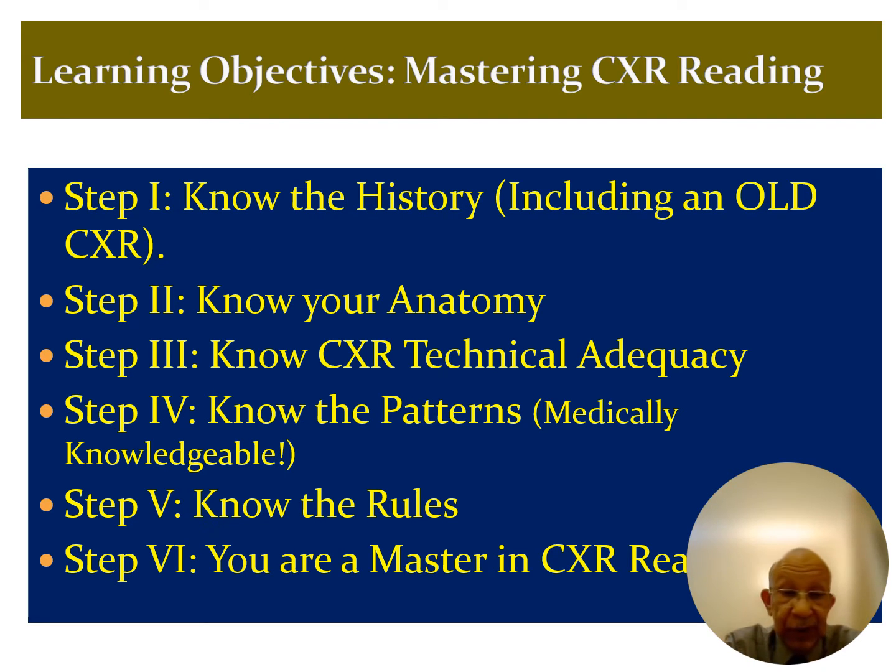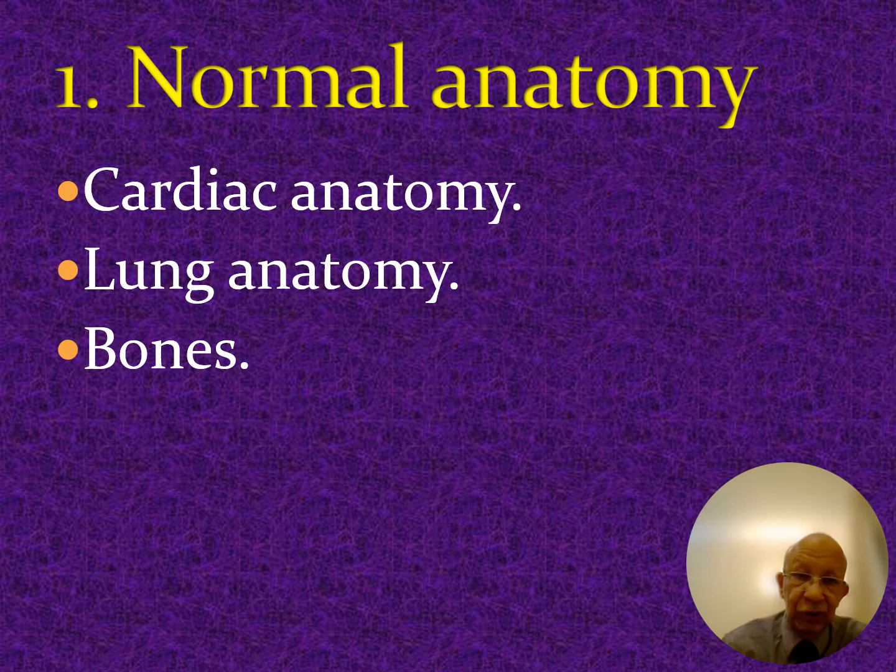A very important and critical step is knowledge about the rules. There are numerous rules which govern what a normal chest X-ray should look like, and you should be quite aware of these rules. If you are really great in all these above 5 steps, then you'd really be a master in chest X-ray reading and interpretation.